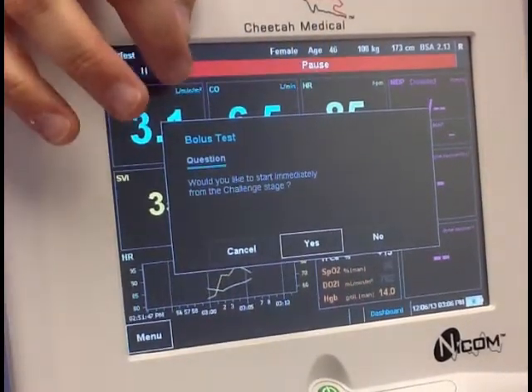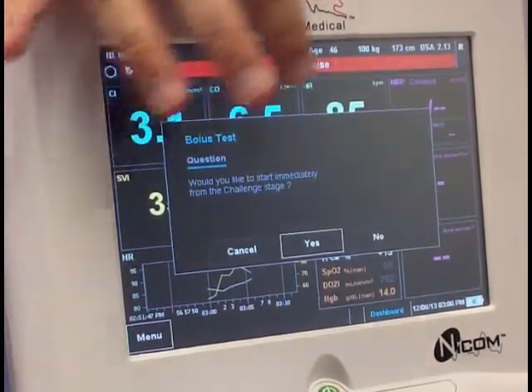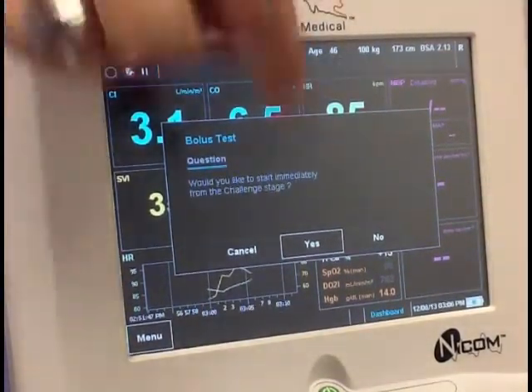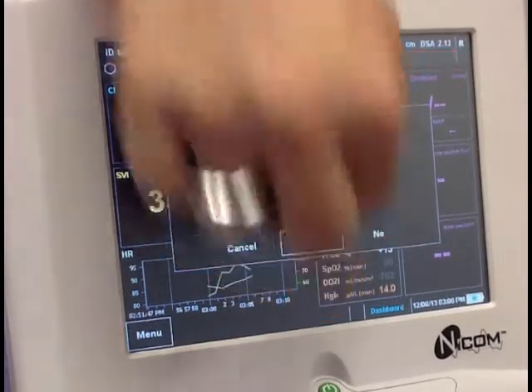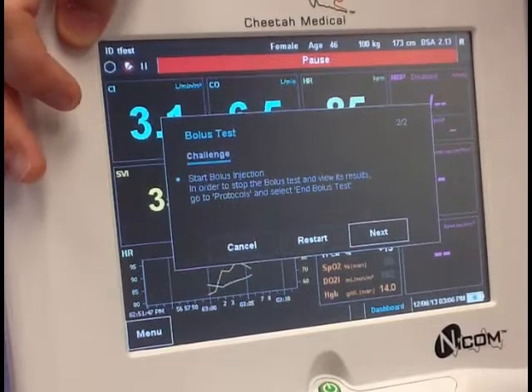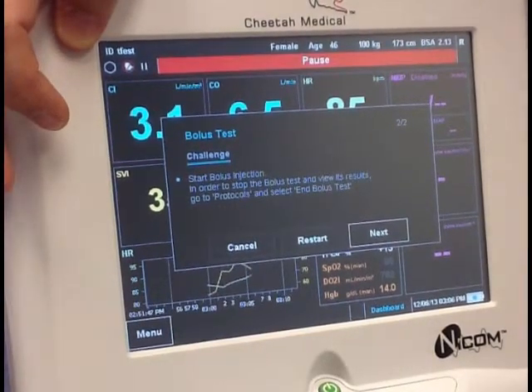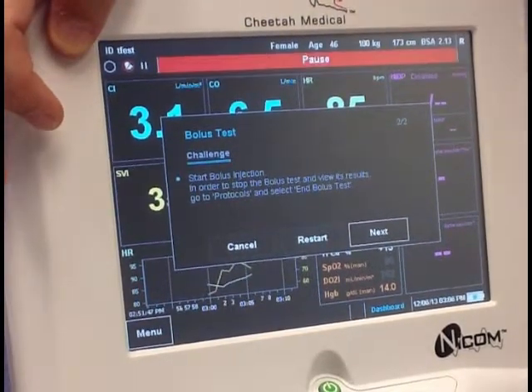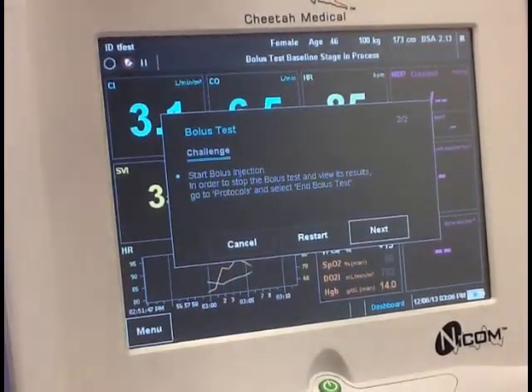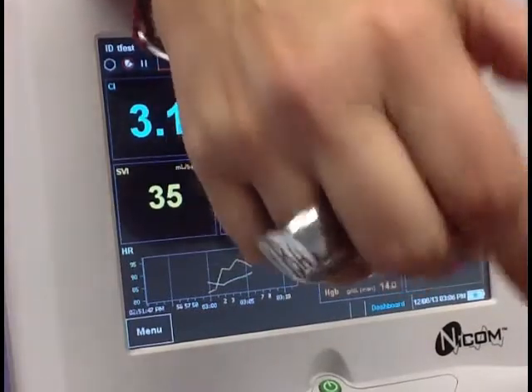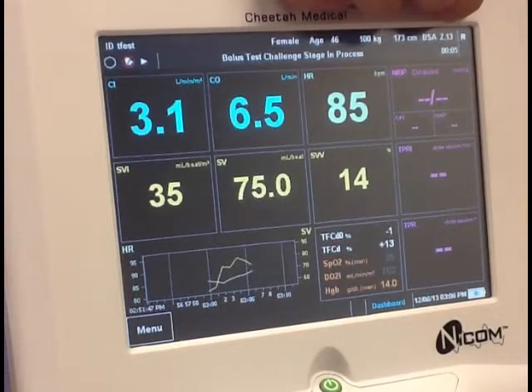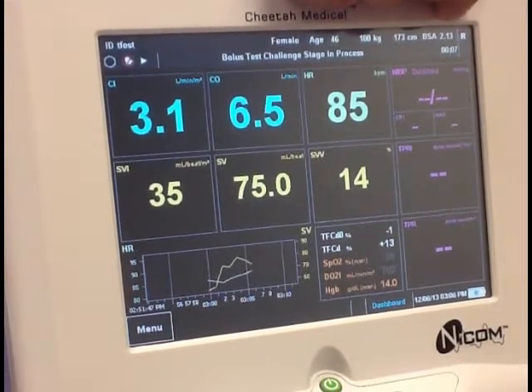It says: would you like to start immediately from the challenge stage? If you're ready to give your bolus, you select Yes, and then it says Challenge. Start the bolus injection. In order to stop the bolus test and view its results, go to Protocols and select End Bolus Test. So right now you would hit Next, open up the stopcock, and start your bolus.